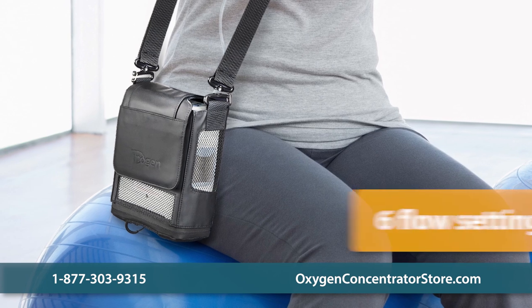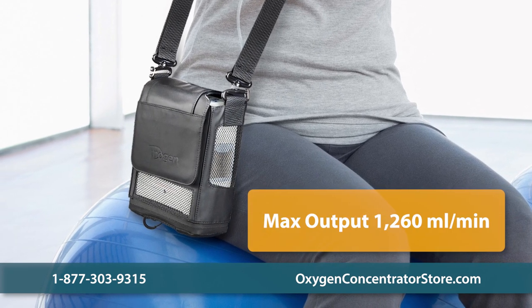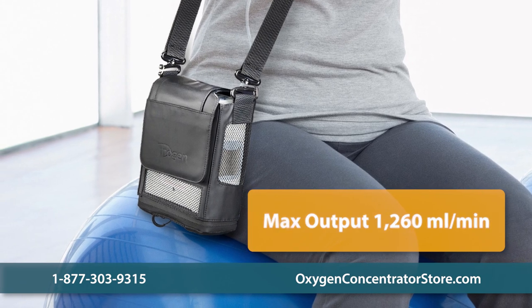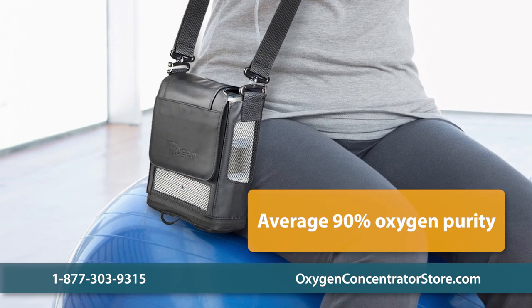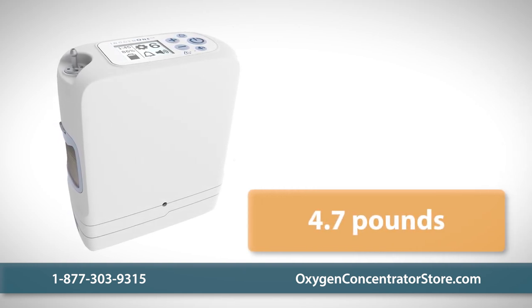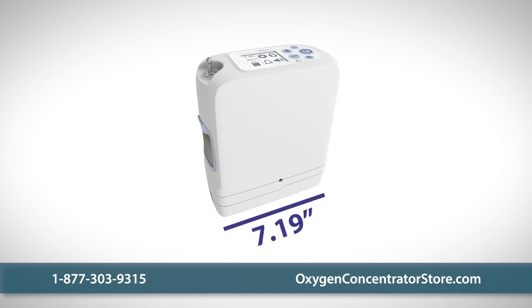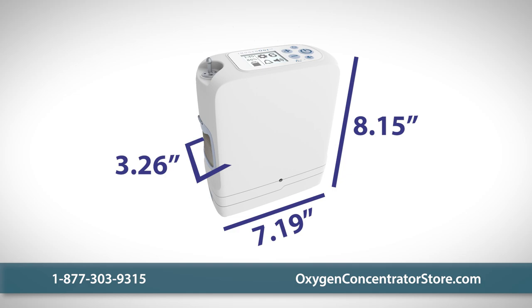The G5 features six pulse flow settings with a maximum output of 1,260 milliliters per minute and an average oxygen purity of 90%. One of the most portable units on the market, the G5 weighs less than five pounds with a single battery and measures 7.19 inches wide, 3.26 inches deep, and 8.15 inches high.